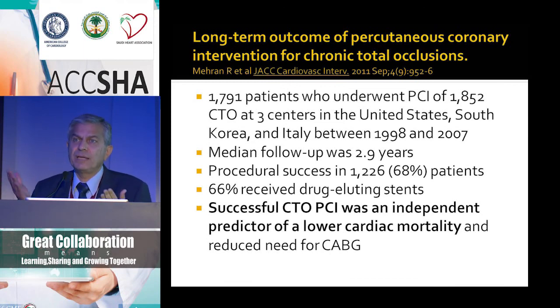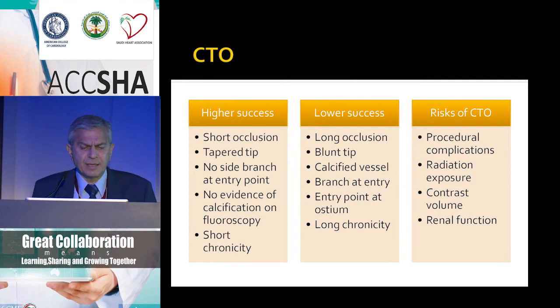Of course, we don't have today a randomized trial comparing leaving the patient alone, versus trying and being successful, versus trying and not being successful. This study needs to be done, but doesn't exist. Now, of course, with CTO, there are indicators of high success versus lower success. There are many gadgets that have come on the market to help us navigate through chronic total occlusions in terms of antegrade approach or retrograde approach.